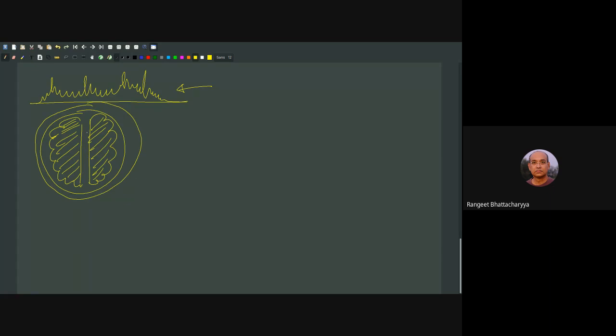That is how it shows up. But individual slices' spectra look quite complicated, not like our simple 2:1 kind of stuff. It's much more complex because there are so many things inside.